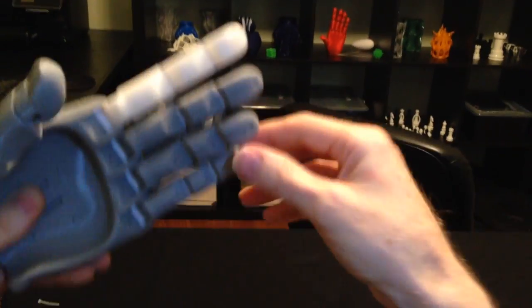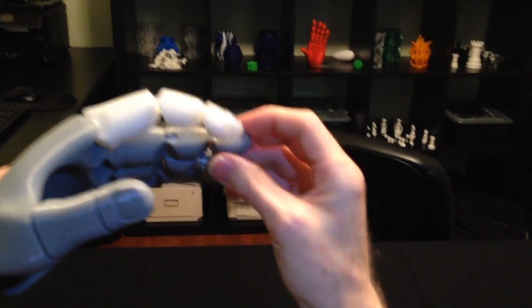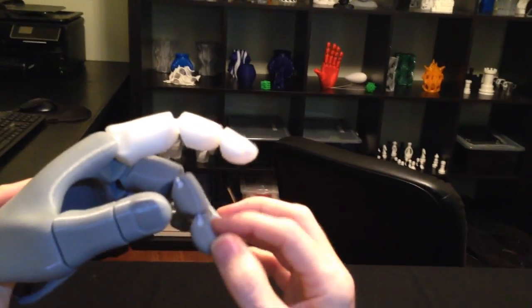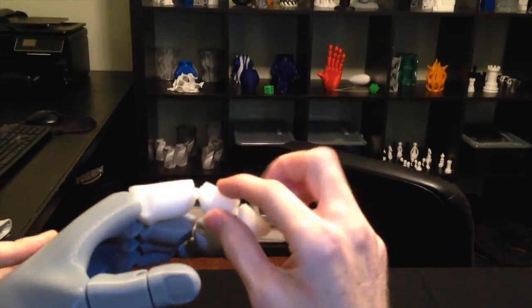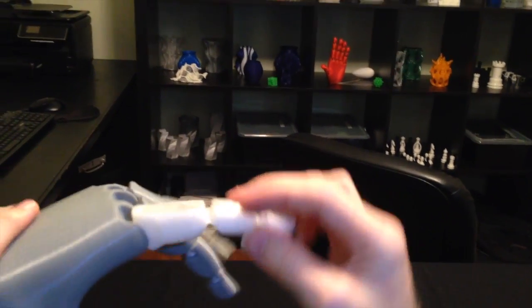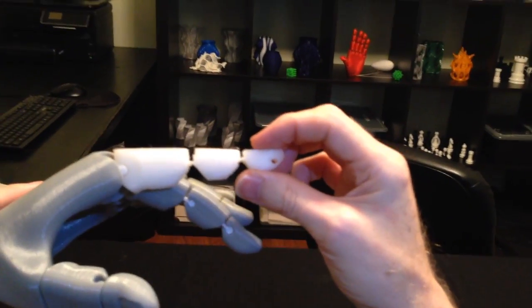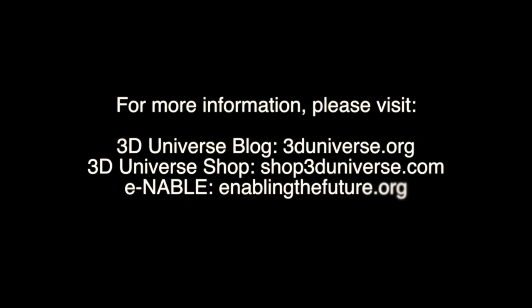As it is right now, it moves every bit as well as the other ones that are done with the NinjaFlex joints. Those actually I made with a little bit too little on the infill — I think I want to go a little more on those because they were also a little too flexible. But in your case here on the nylon, I think that could be addressed just by making those middle pieces just a little bit thicker. But this is pretty cool.